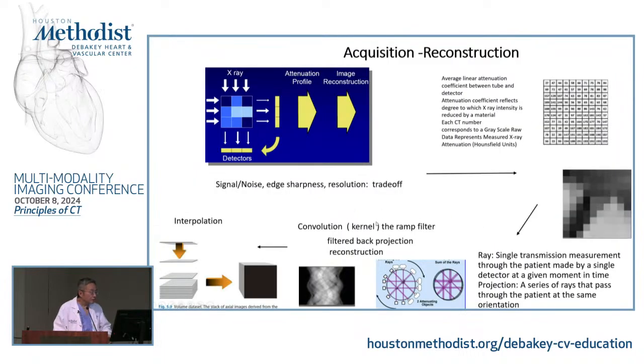Okay, so after we acquire the images, each X-ray goes through the patient's body and comes out with an attenuation number, and everything is a number. And through filtering, which essentially is where we pick up the signal with high frequency because it gives us a better picture, and get rid of some of the lower frequency. So it's to get rid of the blur, and that's what the filtering does.